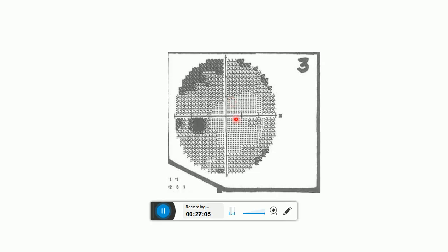Points with sensitivity greater than 40 dB are seen as white scotomas on the grayscale and require careful interpretation. They usually indicate a trigger-happy patient who has responded without seeing the stimulus, for example, a false positive. The grayscale is useful when comparing the fields of a patient on follow-up. It indicates the progression of the visual field both in extent and in depth over time at a glance, given the reliability indices are within normal limits.